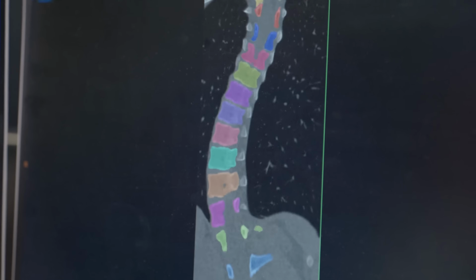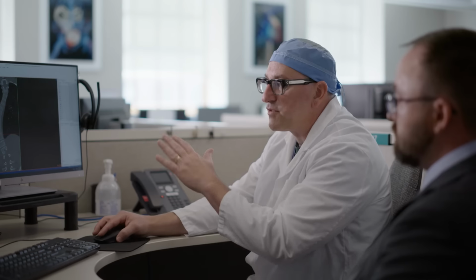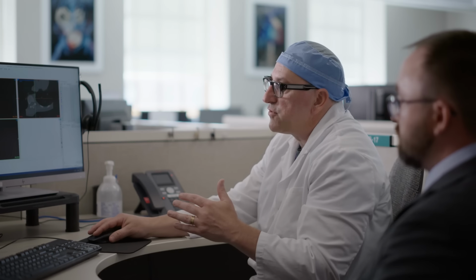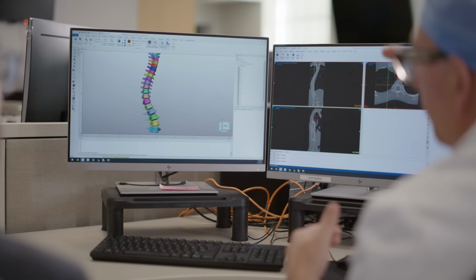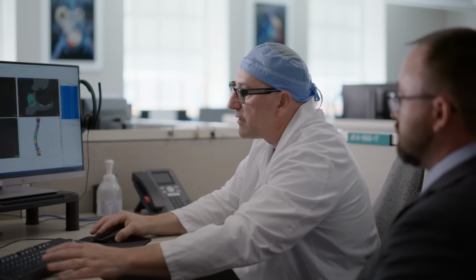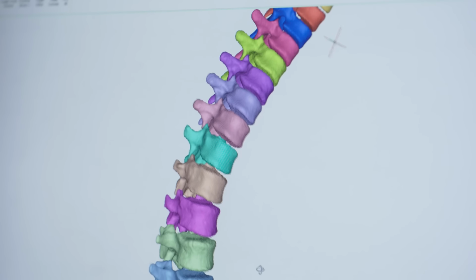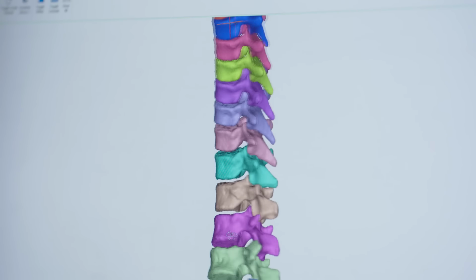This is a young woman who is 13 years old who has a progressive curvature in her spine, which is really progressing fast over 4 months. And typically, in order to be able to make a model of this, a technologist would have to level by level hand color in each bone. But now that we have this AI algorithm, not only can it segment the bones, it can auto-label which bone it is. Now we can go from a scan to this in about 4 minutes.